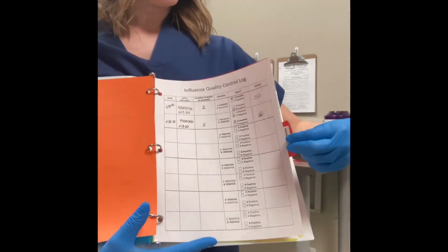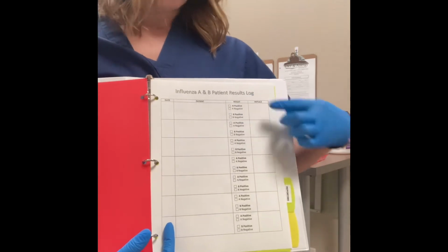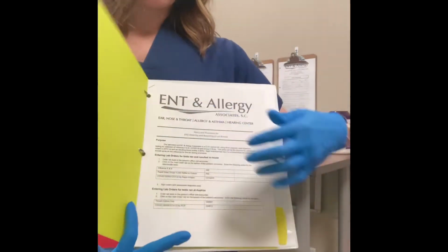Next, you'll find the results log. This is where you put a patient sticker and put the positive or negative results. And lastly, you'll find how to report those in Epic.